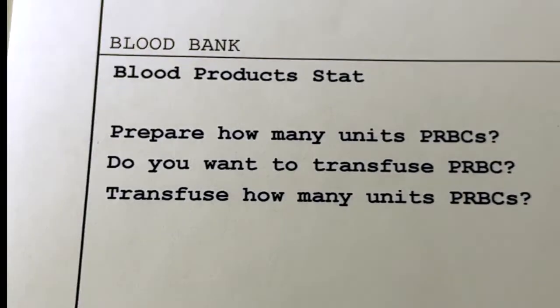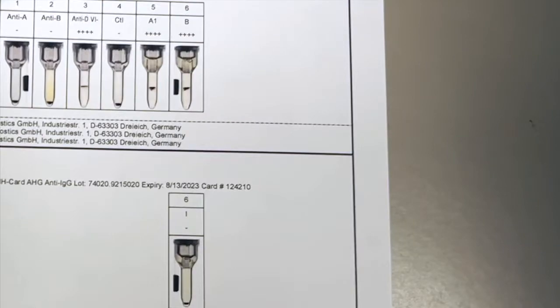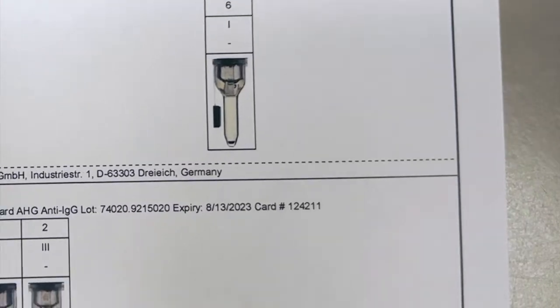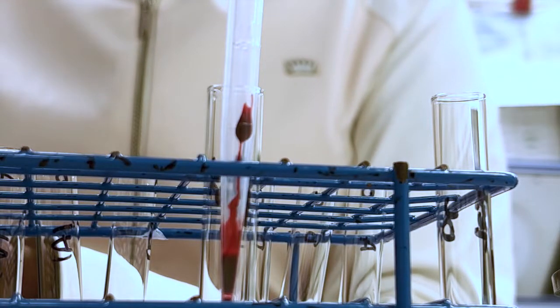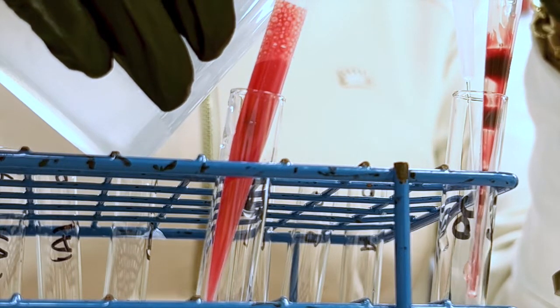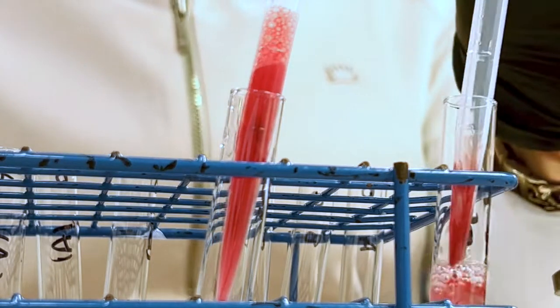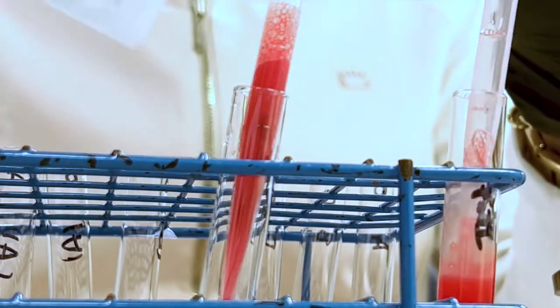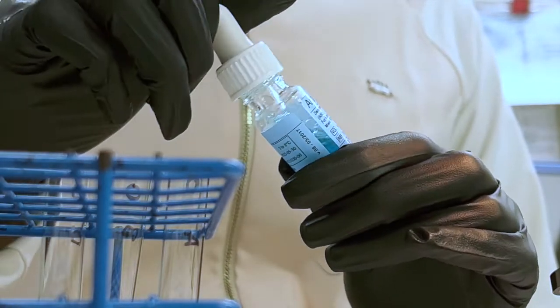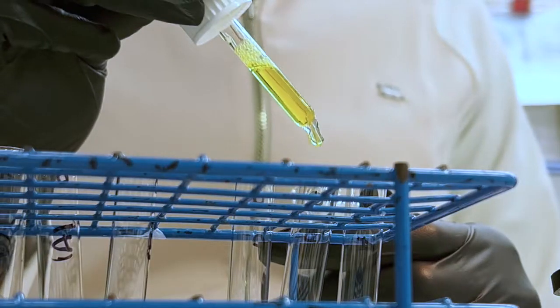If you have a blood bank analyzer, you will just put your sample on and then you will have your results, the type and the screen. But if you're at a hospital that doesn't have an analyzer, you would just set it up at the bench. So here I am setting up my 3% cell suspension, adding in my anti-sera for my forward type.